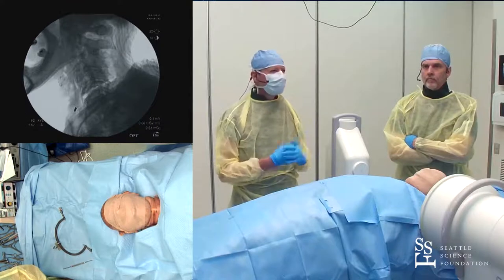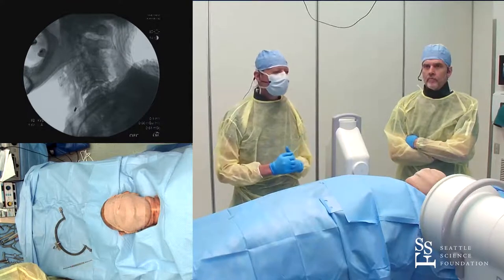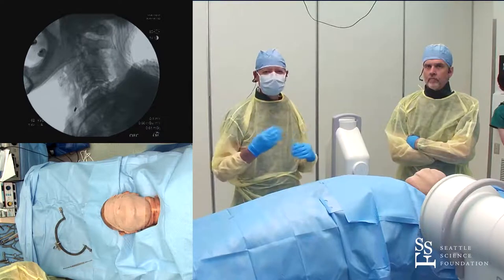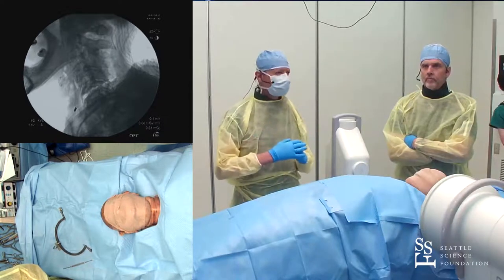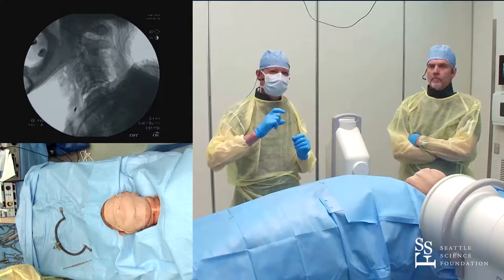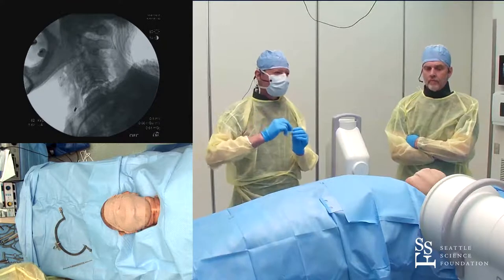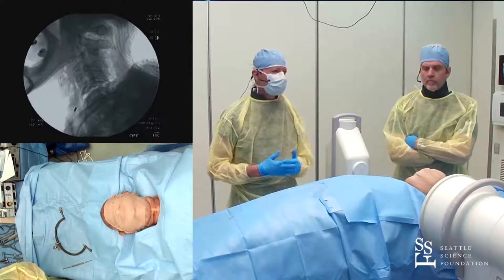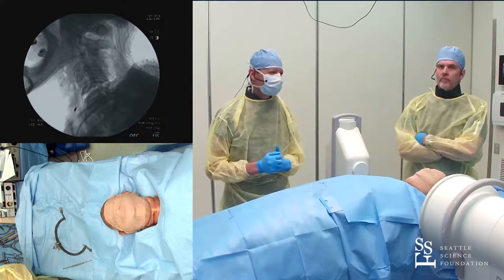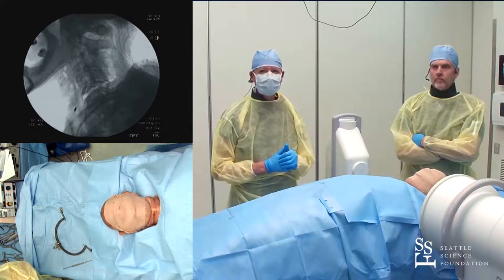Once you get past maybe 50 pounds, something else is going on. In my experience, it's usually a facet fracture. With facet fractures, you're never going to reduce because you're pulling through the fracture — you won't be able to disengage that fractured fragment and reduce it. So if you need more than 50 pounds, I think it's probably not going to work.